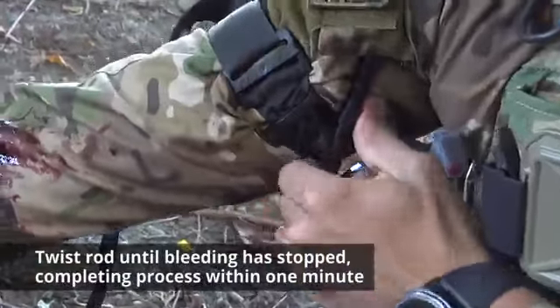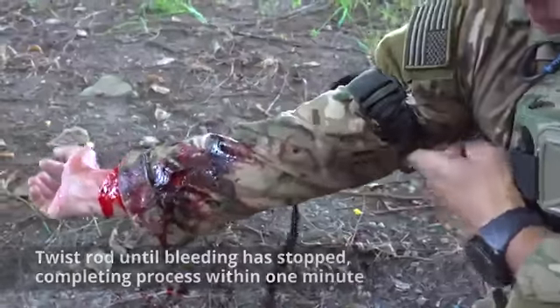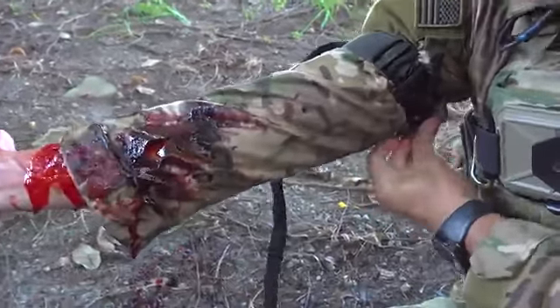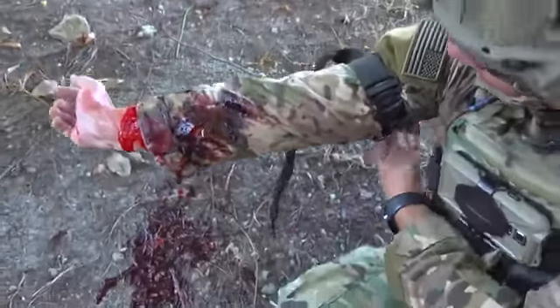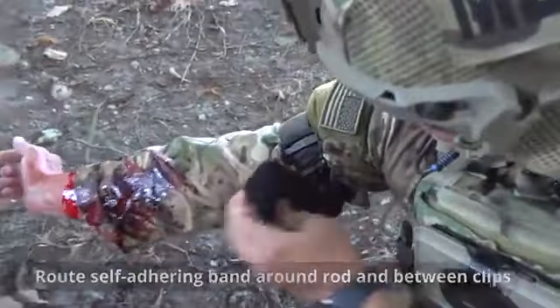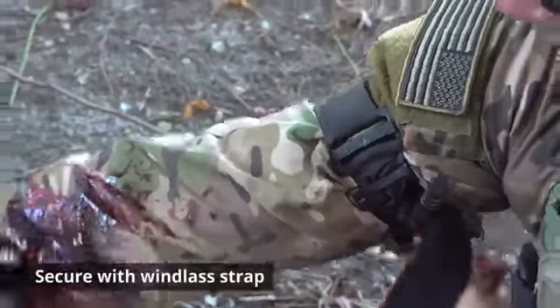Twist the rod until bleeding has stopped, completing the process within one minute. Lock the windlass rod in place with the windlass clip. Route the self-adhering band around the rod in between the clips and secure with the windlass strap.